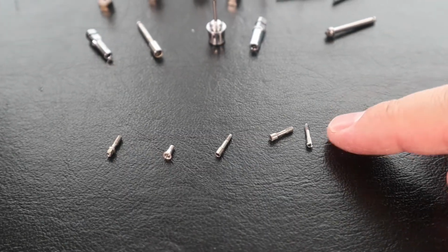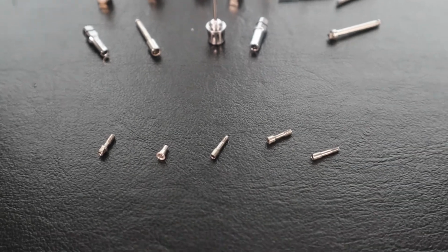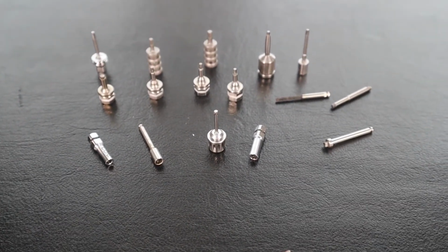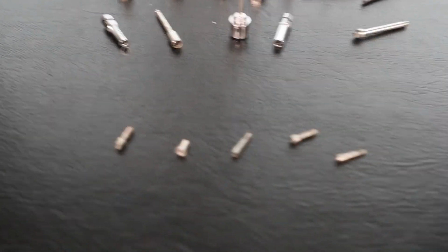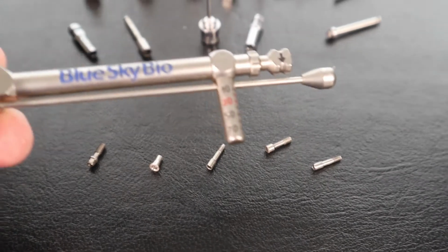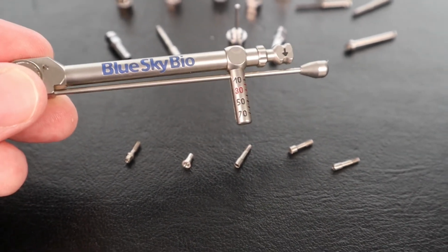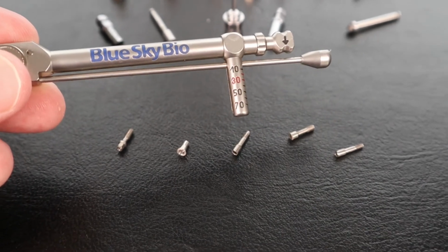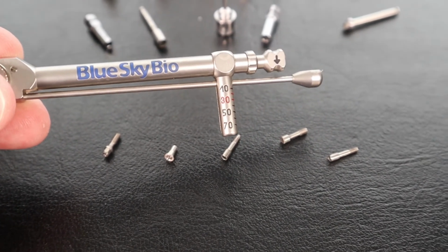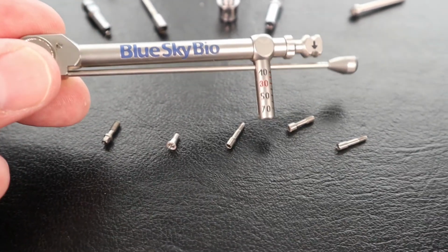These are some of the screws that we use the drivers on. As you can see, they're very small. That's why the drivers are so small. In addition, because the screws are so small, that's why we only use pretty low torque values. So generally in implant dentistry, most of the time we use anywhere between 20 and 35 Newton centimeters of torque.